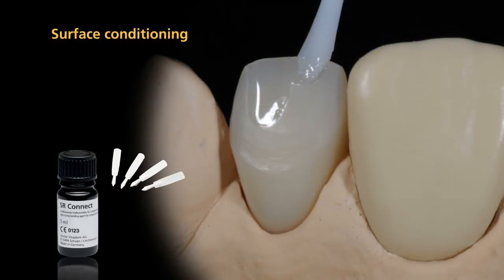SR-Connect is used to modify and characterize dentured teeth with SR-NEXCO. SR-Connect is a light curing conditioner. It bonds light curing veneering materials to PMMA, heat and cold curing polymers, and resin dentured teeth.